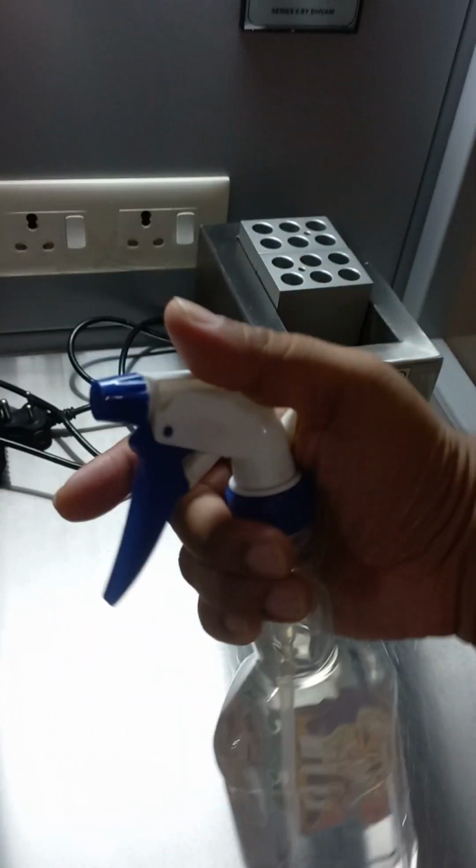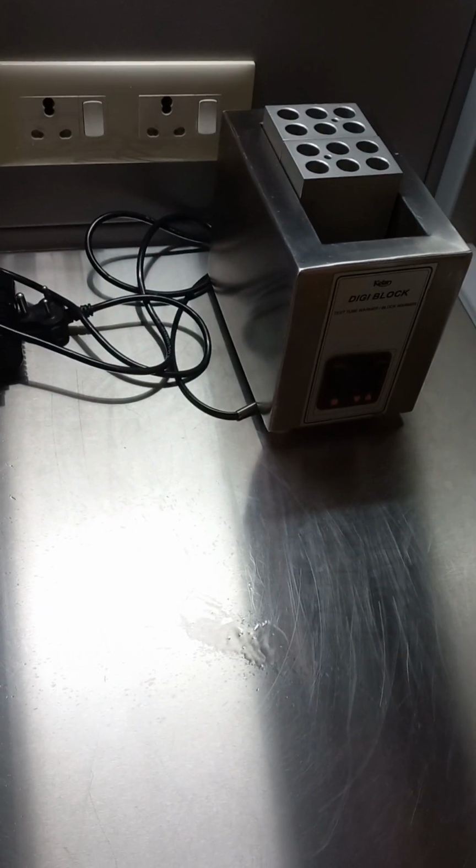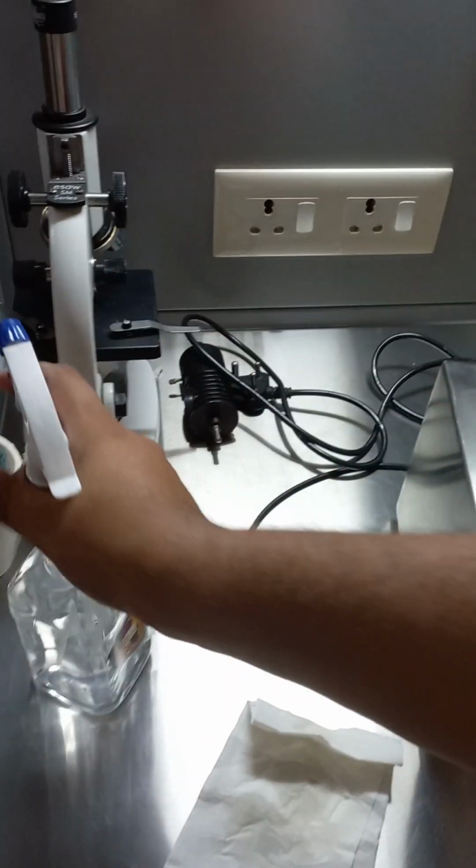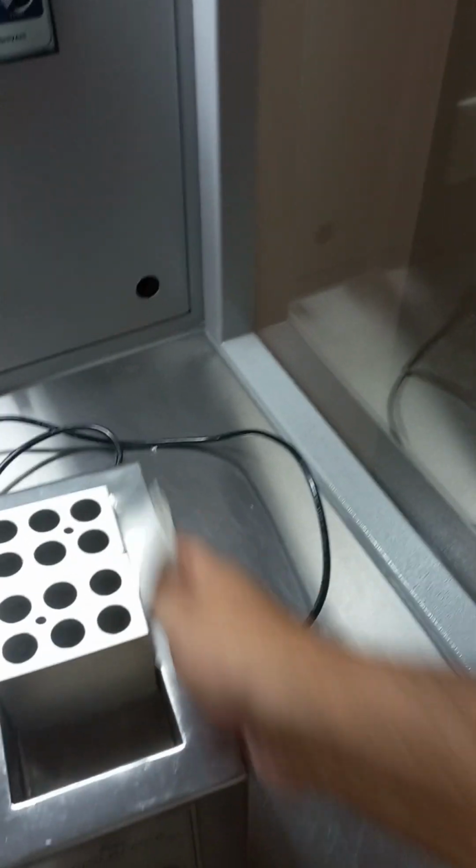All that I am using is clinical spirit, which we have put in a spraying container, and this is how we spray. And then we take a standard toilet paper roll, we roll it like this, and we do the good old cleaning. You have to do this before the procedure. So this is almost done every night before we go ahead with our cases the next day. I thought of showing this to you because there are so many chemicals on the market for cleaning different things, but the standard spirit works very well.